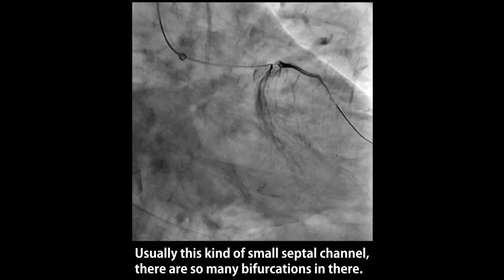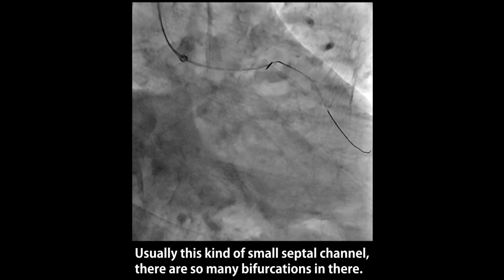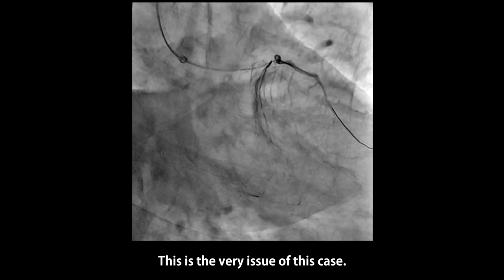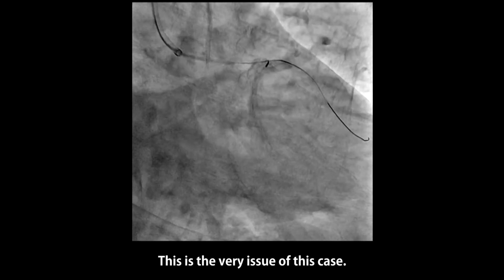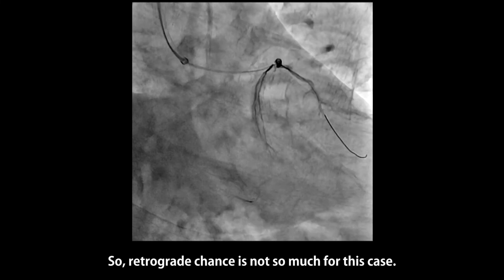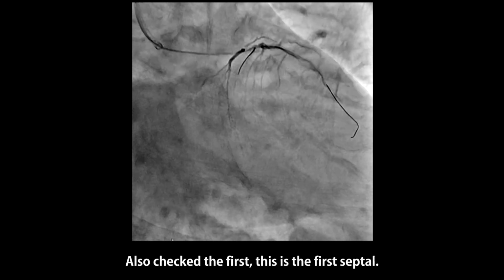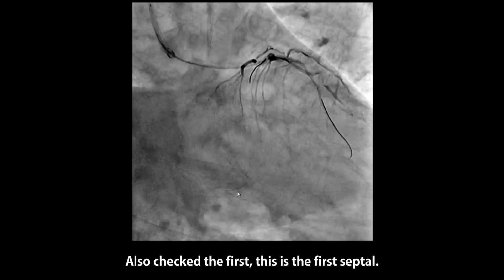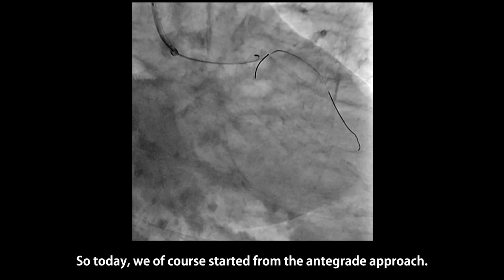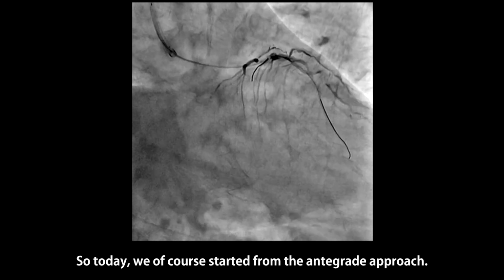Usually with this kind of small septal channel, there are so many bifurcations in there, so selection is usually very difficult. So this is the main issue of this case. Literally the chance is not so much for this case. This is the first septal. The first septal connection is also misty.